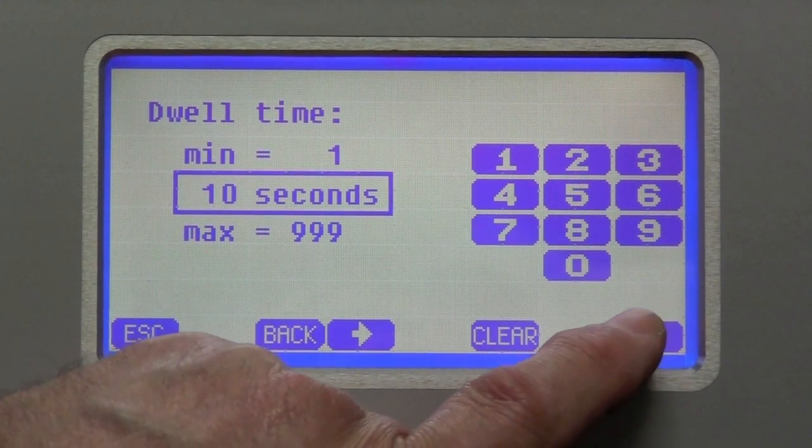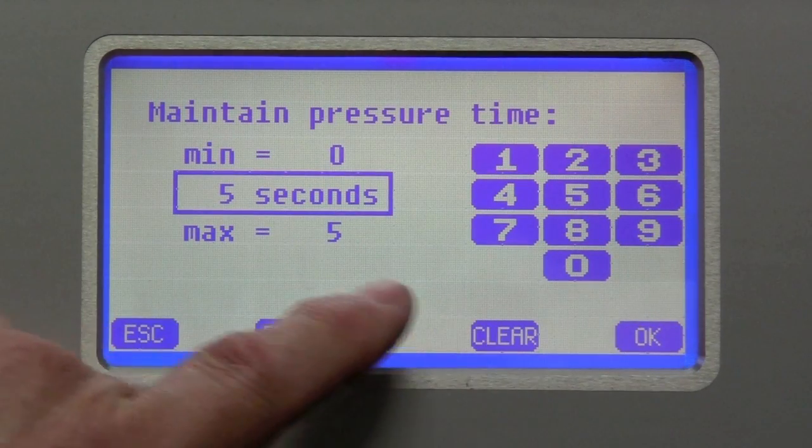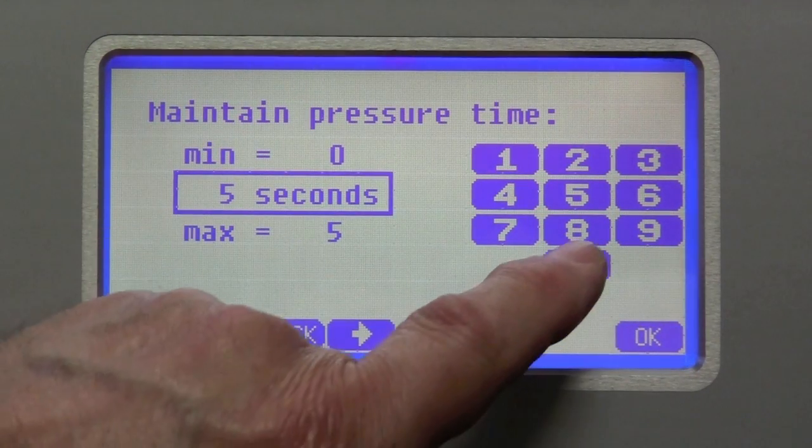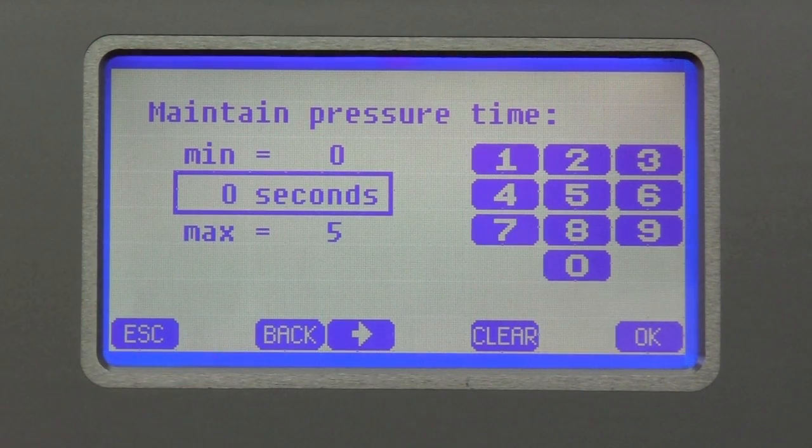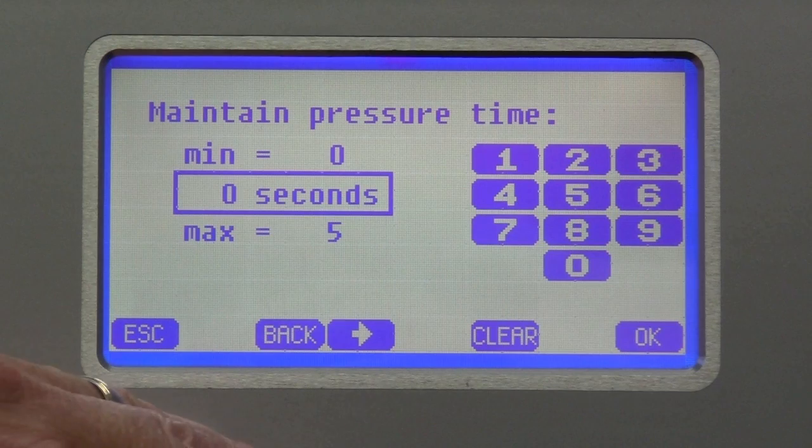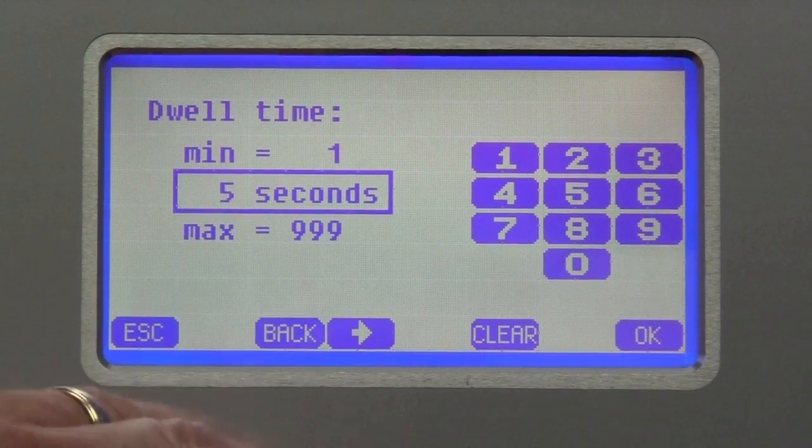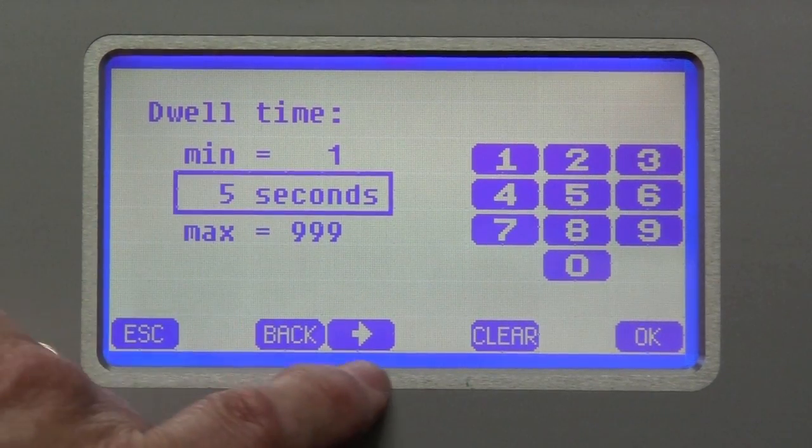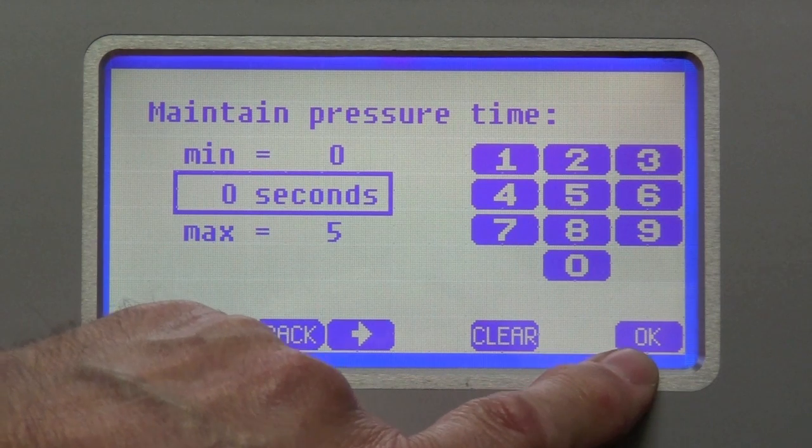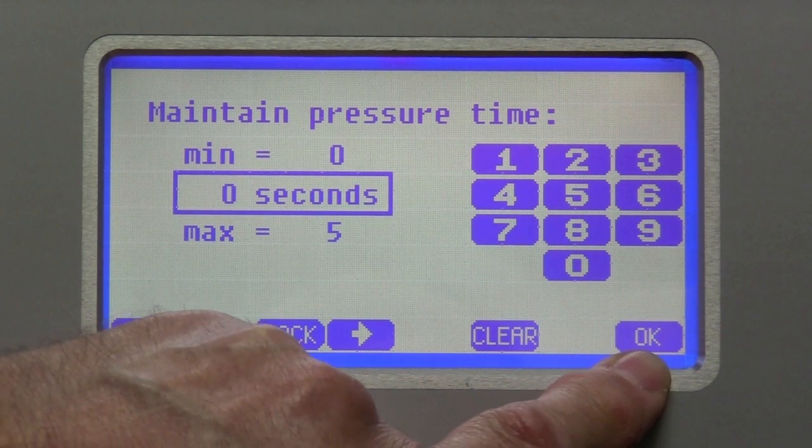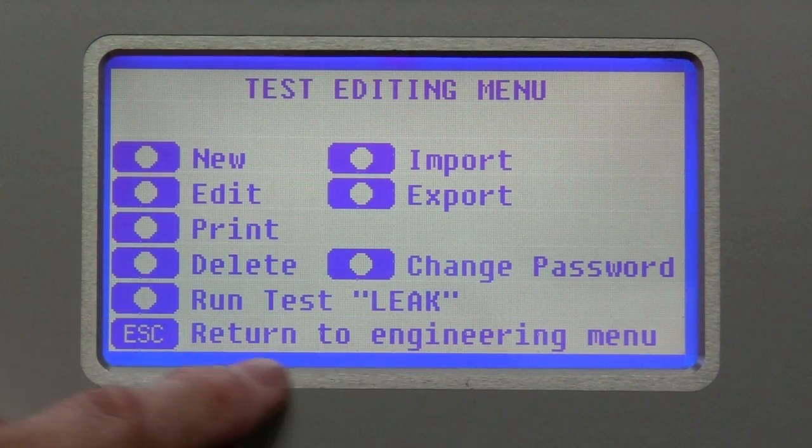The dwell time we're going to leave at, we're going to put at 5 seconds. And we're going to have the maintain be 0. So what that means is that it will go to the target pressure and it will wait there for 5 seconds. It'll wait there for 5 seconds and then we'll make the maintain 0. So during that period of time, it will not maintain the pressure. And so if the pressure drops, there must be a leak.